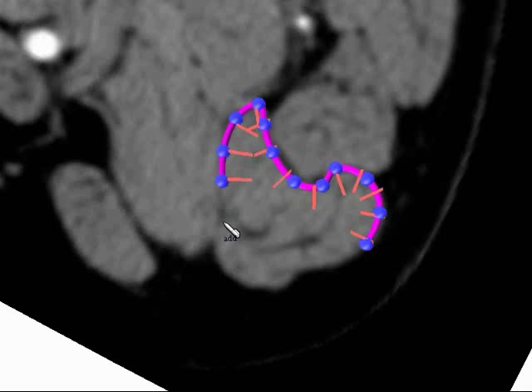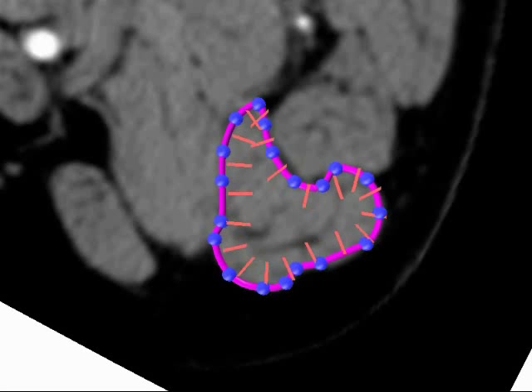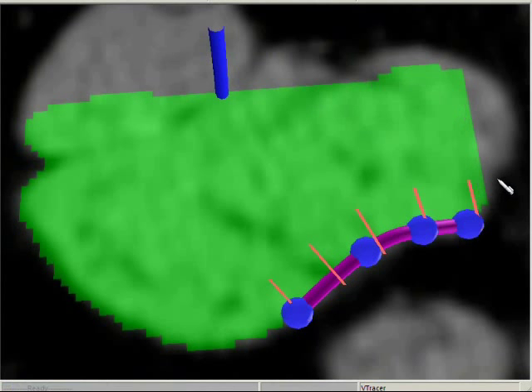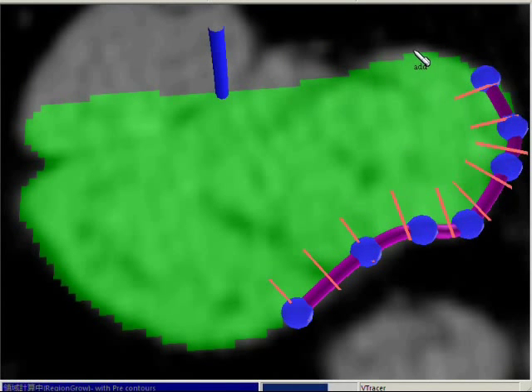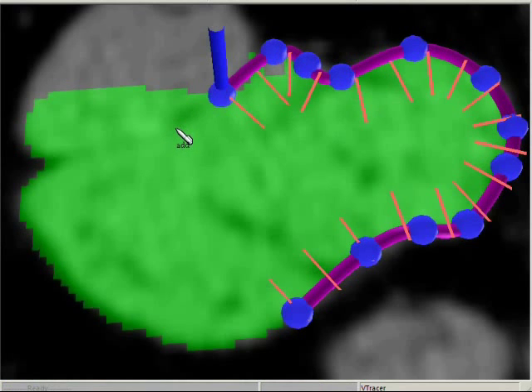When the user clicks on the cross section, control points are placed and they are interpolated to generate a contour. The user can choose open or closed contours and switch sides. After each manipulation, the segmentation boundary is immediately updated.